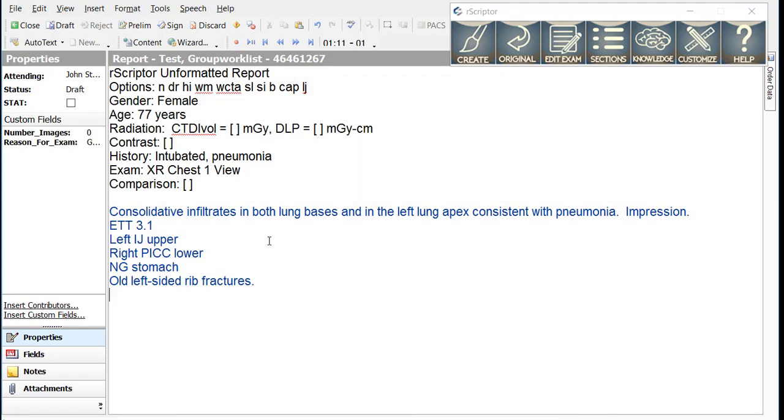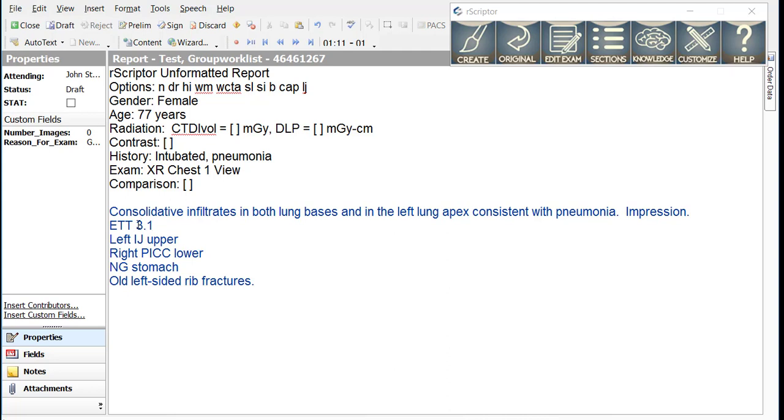You can see from this dictation that we have a description of pneumonia that we're going to place in the impression. And then we have several statements about devices that are in place. An ETT which we give the dimensions of the tip above the carina, the location of an IJ, a PICC line, and an NG tube.